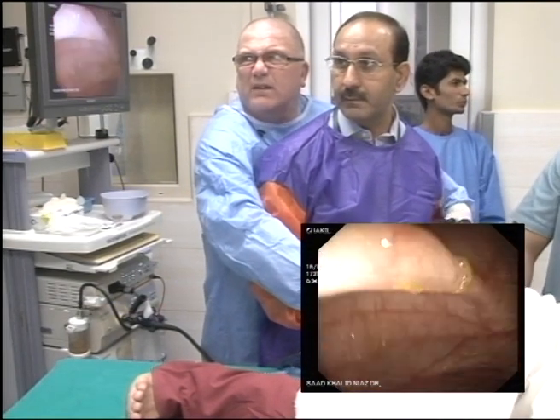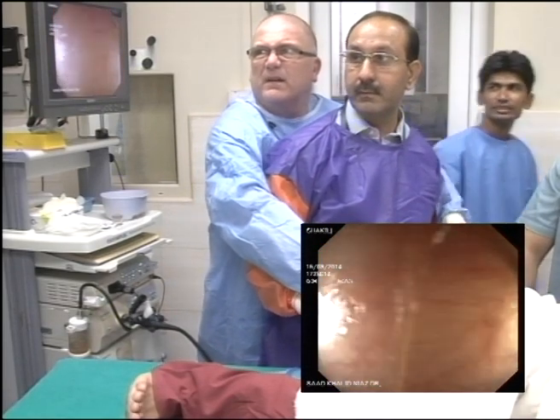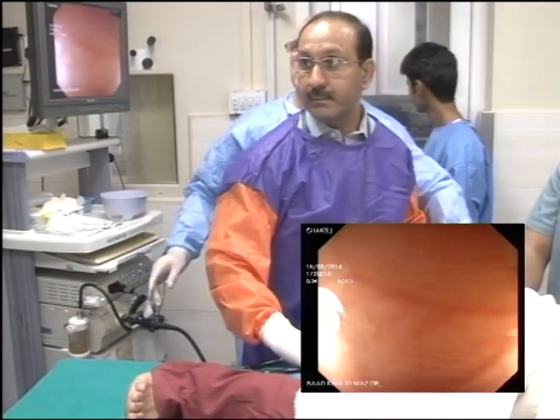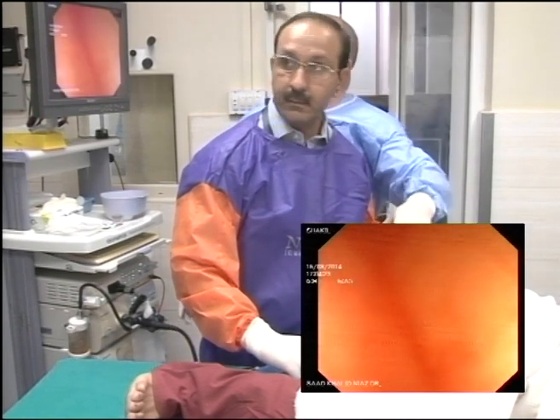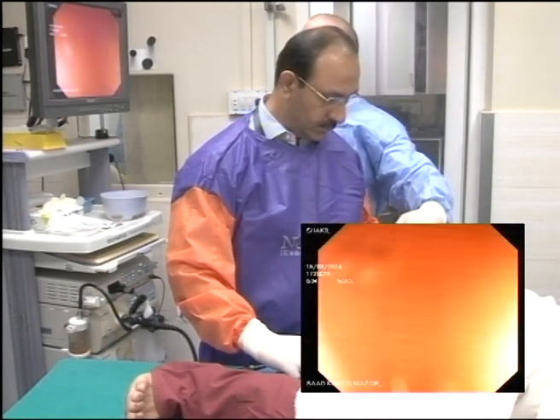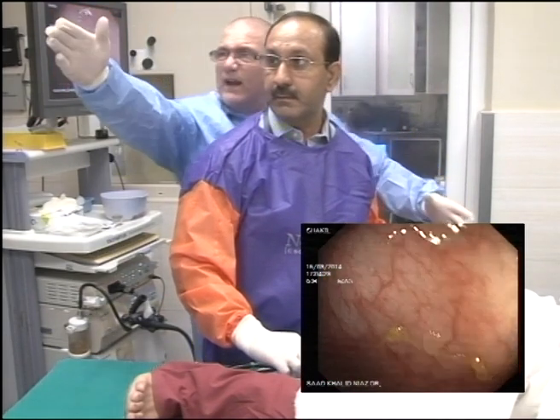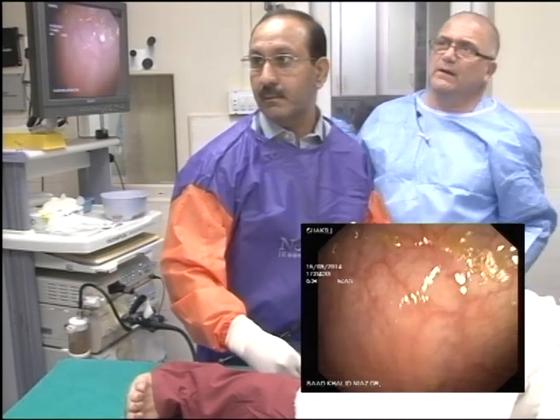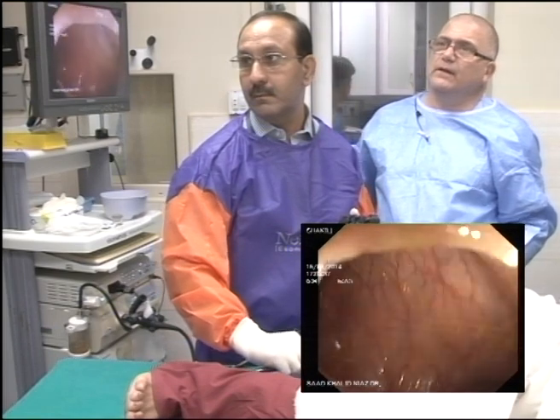Let the scope come back slowly. Bit further. That's it. And let the scope relax onto the bed. Big wheel back. That's it. And neutral. That's it. It only comes back so far because all you're doing is lifting it out of the way. And now you can find your way. That's good.